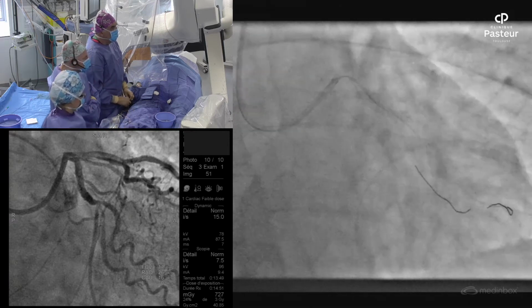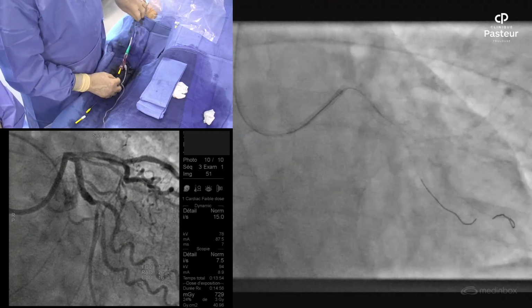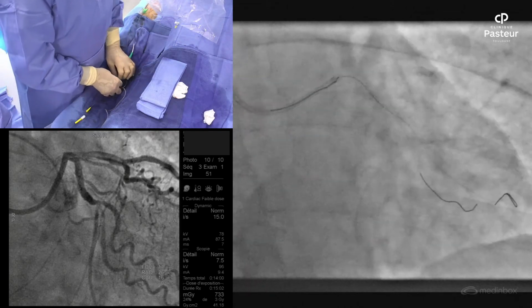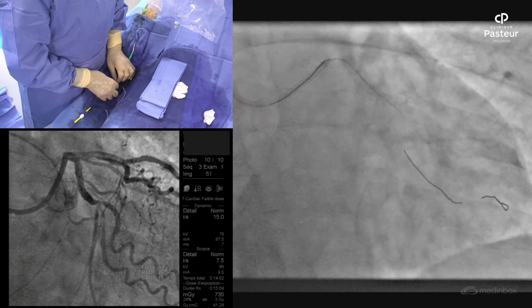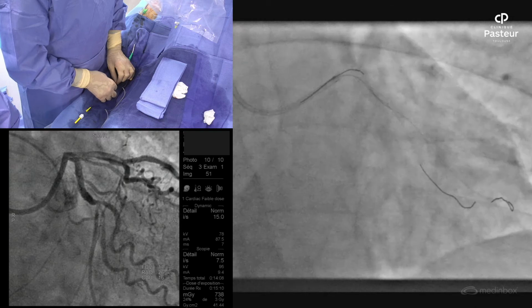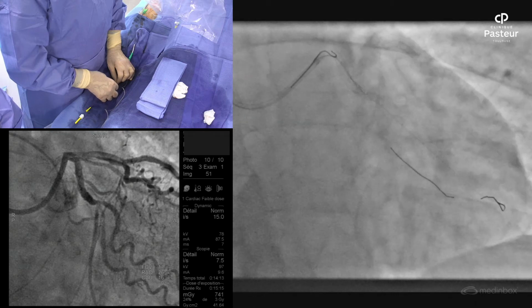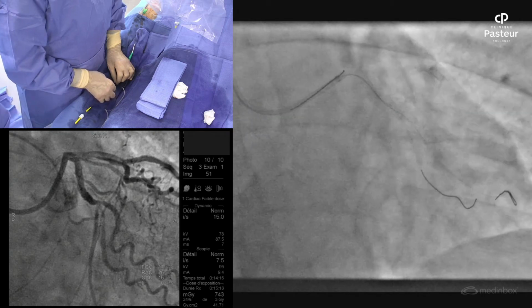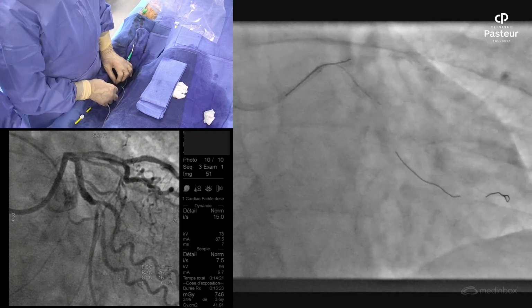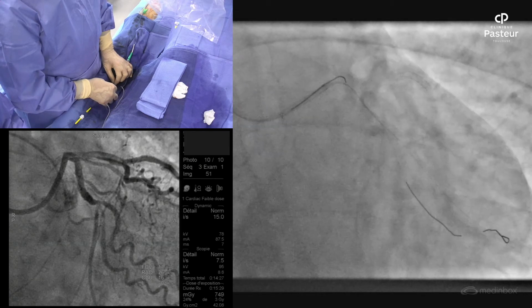So here we will arrive inside the left main. I disengage the guiding catheter a little bit, and we see that there is a horizontalization of the tip of the guiding. Now I will advance slowly. We have to be sure that we are in. I don't want to force. This is good because we are in the LAD. I pull back, I turn clockwise, to jump in.